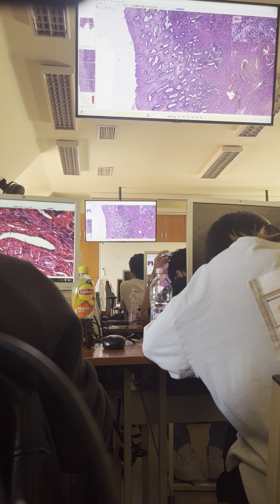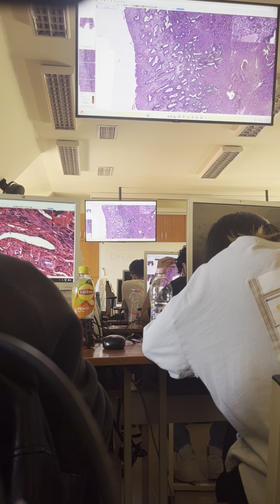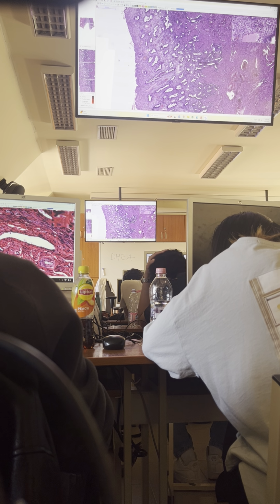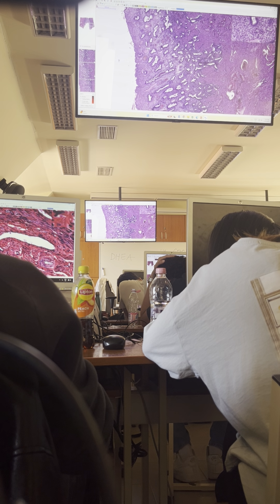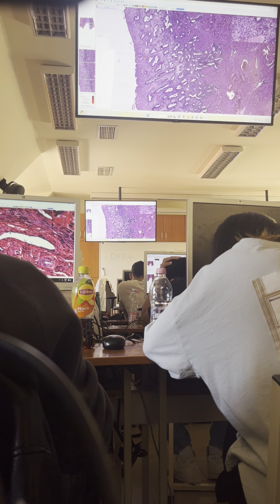Now, the process which is going on here in the spongy layer is edema. Edema is when fluid accumulates in the extracellular matrix of a connective tissue and it is getting swollen. This is what we call edema. You have probably heard about it. You should have in first semester. In relation to which substance?